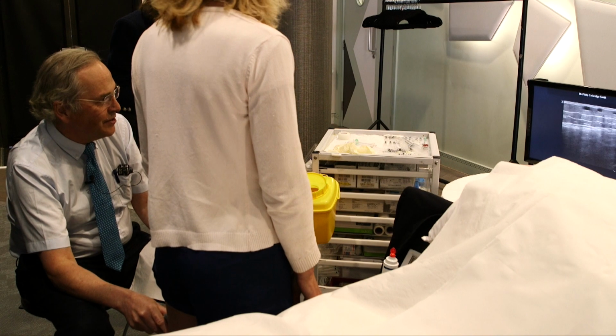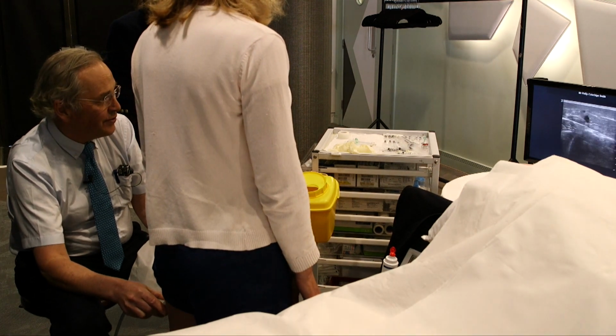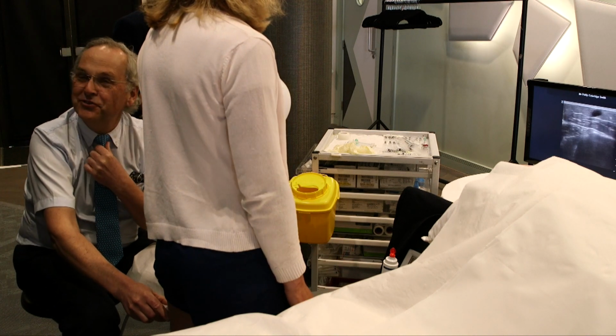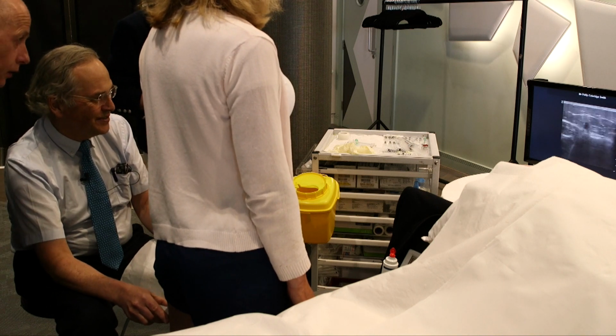So, amongst other things, this is what we're treating today. This is a lateral thigh perforating vein on the subject. Since Jonathan Earnshaw was talking about perforators and the fact you don't need to treat them, I thought we'd treat this one because this is the source of the trouble.